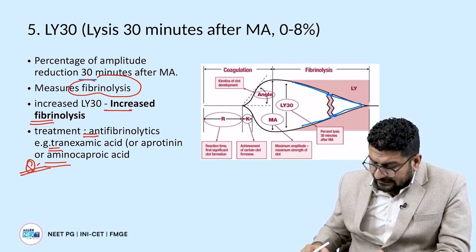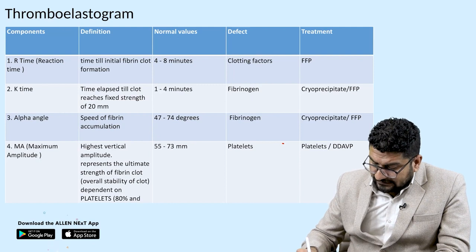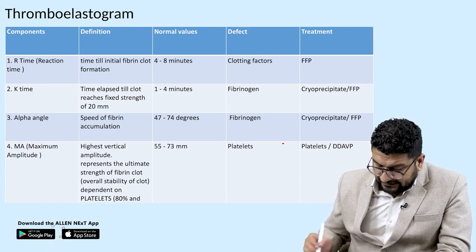So once you understand this, we have different components. So let us summarize each of these. So first is R time.